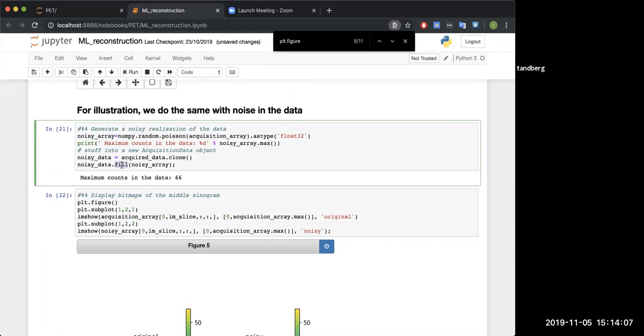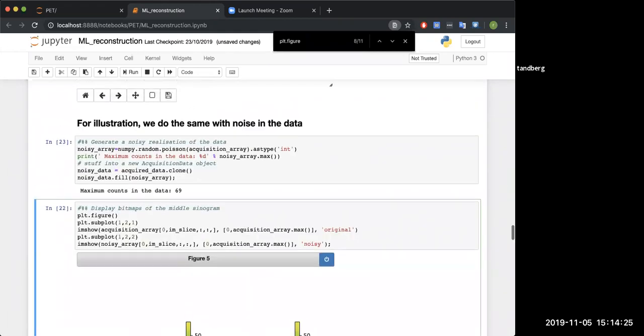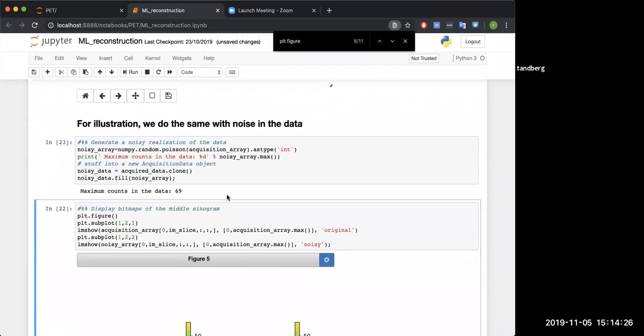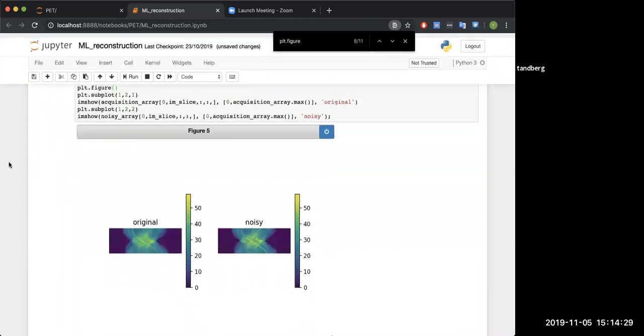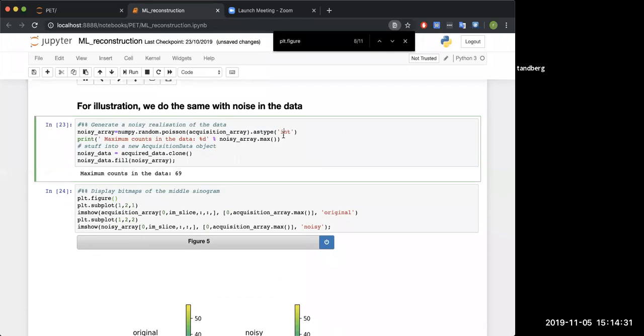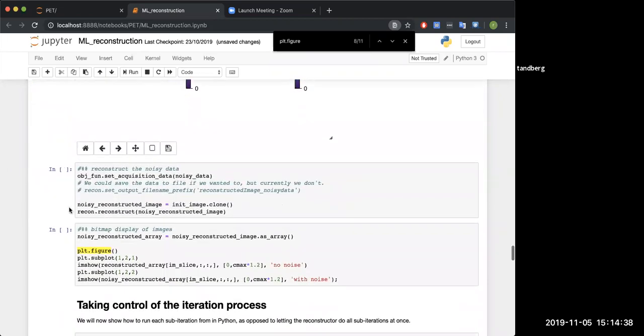Why do you add the noise in as a float 64? It could probably be a float 32. This fill method will convert it to a float 32. The output of that will always be integer numbers, but in turn, the objects will convert it into a float anyway. Because often when you do simulations, you don't have integer counts.